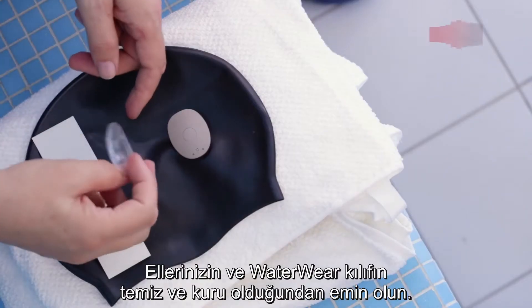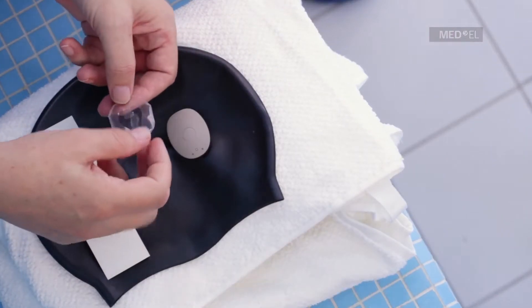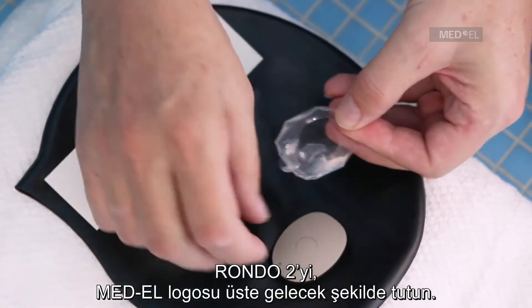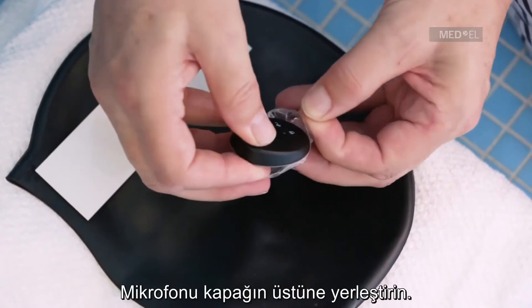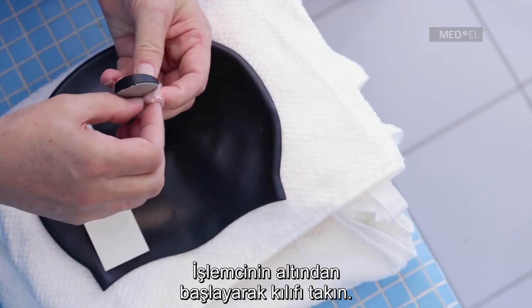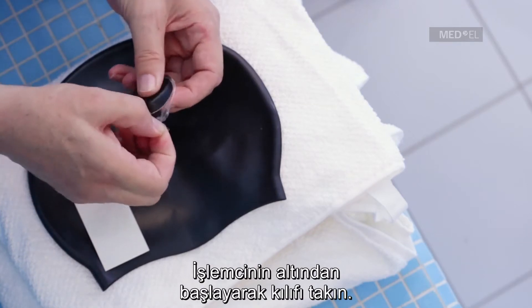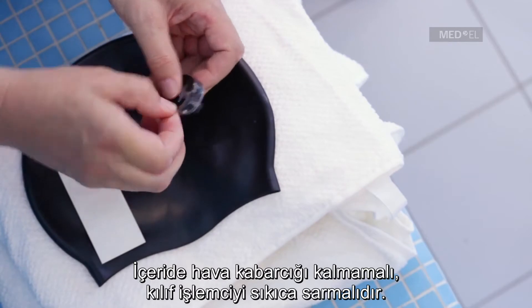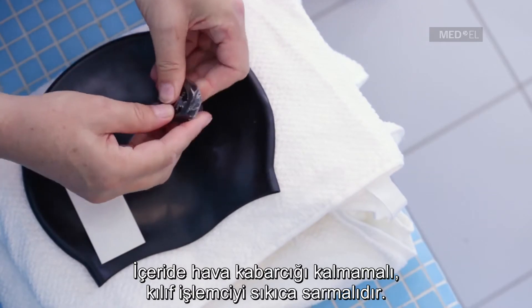Check that both your hands and the waterware cover are clean and dry. Hold RONDO 2 with the MED-EL logo facing upwards. Insert it microphone first into the cover. Take the flap at the bottom and pull the rest of the cover over the processor. Make sure the cover fits snugly around the processor without any wrinkles or air bubbles.